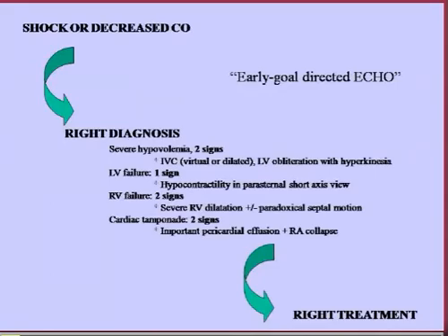And so, for instance, at 2 in the morning, you take a patient in charge for clinical signs of shock, or because you have a continuous monitoring of cardiac output, you see a significant decrease in cardiac output, and you want to know why. And if you want to know why, you can do the right diagnosis using a transthoracic echo, very focused on simple parameters.